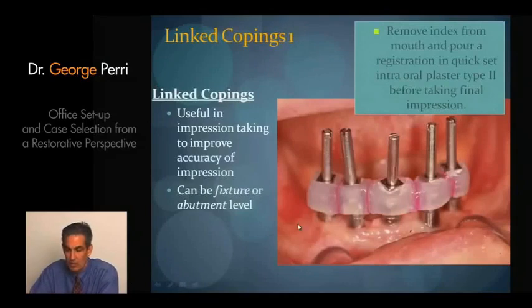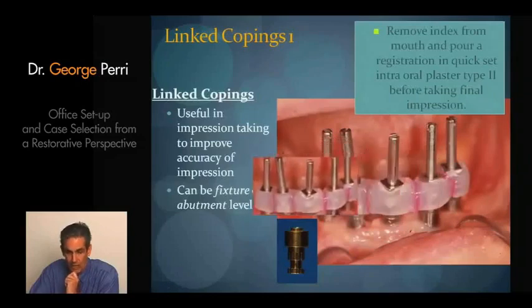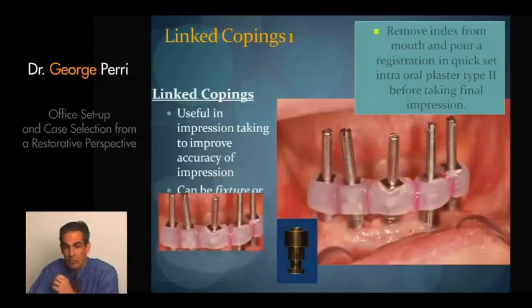So chairside we will disconnect these linked copings, but since they're just held in place by these guide pins, we can undo the pins, remove it from the mouth, connect them to an analog that matches that case, run into the lab, and we can pour this registration, and I like to use intraoral plaster.